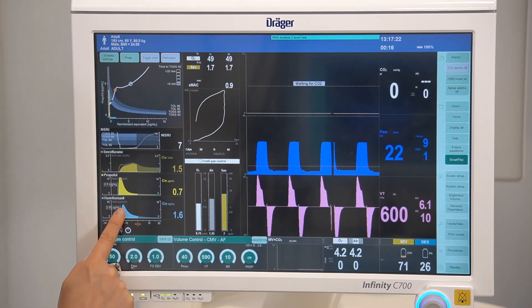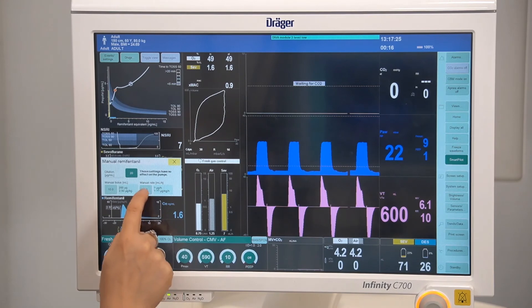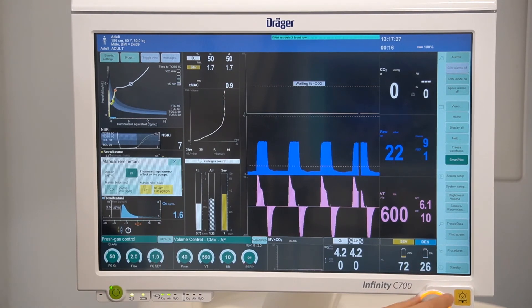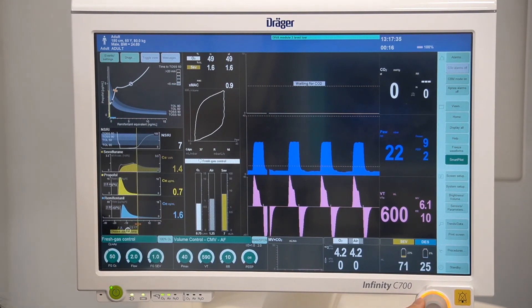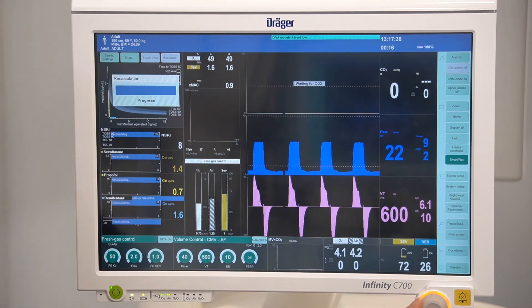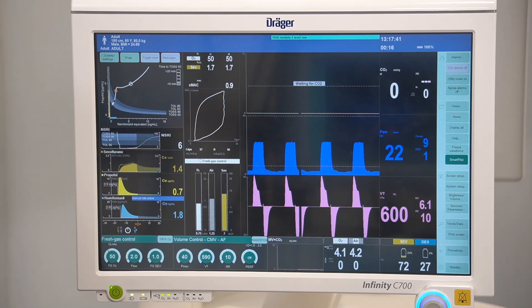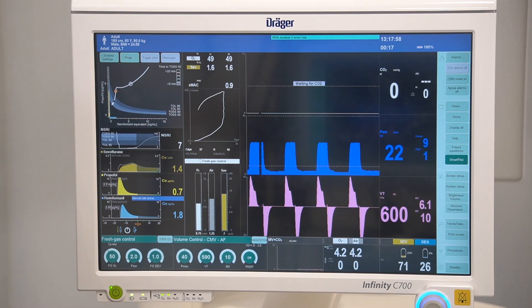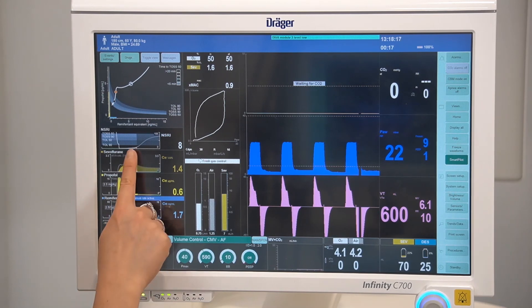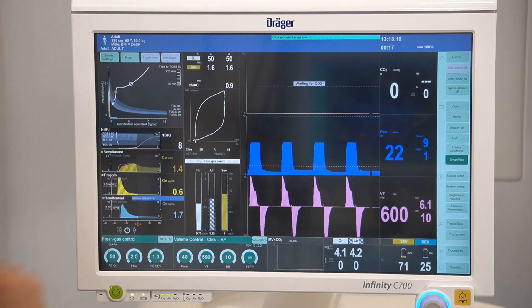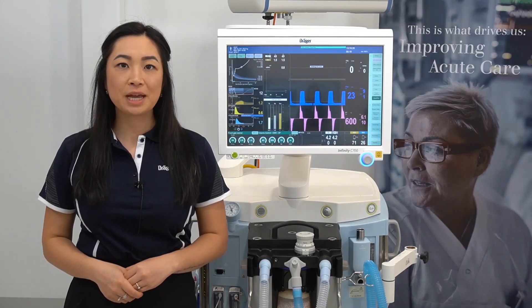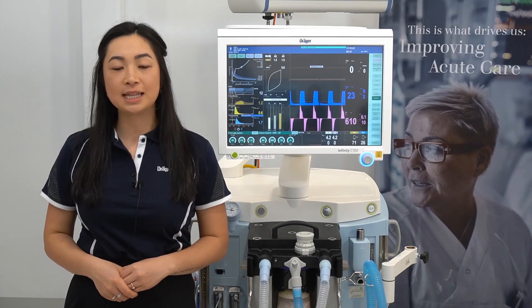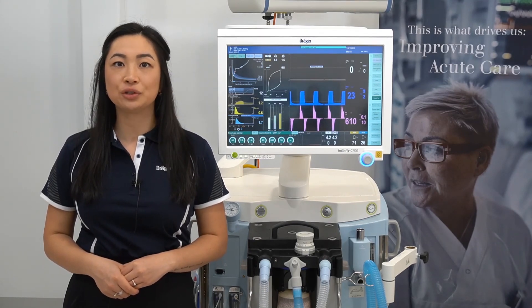By entering a remifentanil rate, you can see a colored syringe icon with an arrow displayed to represent that a manual rate has been entered. You'll also notice that the NSRI prediction has changed shape. For further information on smart pilot view, please refer to the instructions for use or contact your local Draeger representative.